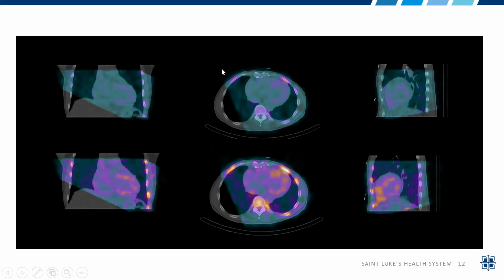it speaks to the fact that SPECT, and particularly SPECT CT, can be helpful. And then number two, like I mentioned earlier, if there's any concern, you've got to go forward with some additional definitive testing, like endomyocardial biopsy.